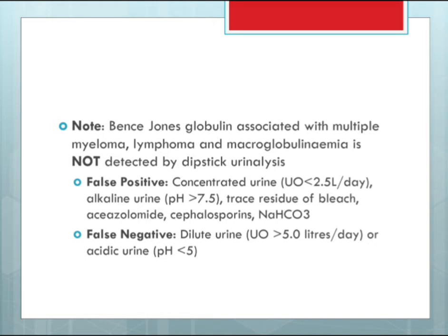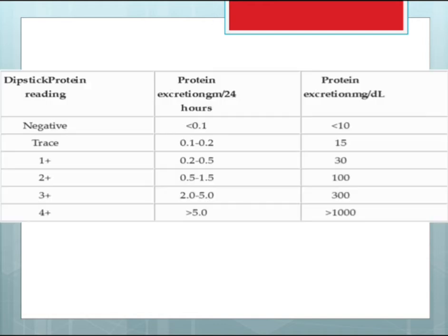Note: Bence Jones protein associated with multiple myeloma, lymphoma, and macroglobulinemia is not detected by dipstick urinalysis. So basically, this is a table showing you the results of protein in urine and the values.